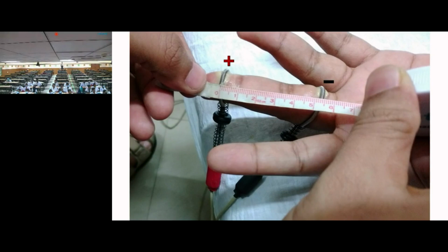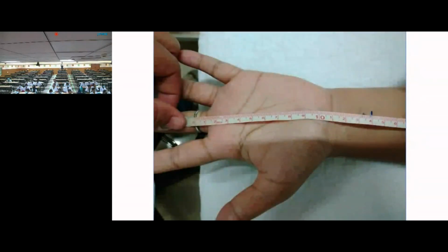Now we have to stimulate the nerve at a distant point, right? So usually for median nerve, we'll be keeping at 14 centimeter. That is where we are going to get the adequate response. So along the course of the nerve, from the active electrode, measuring 14 centimeter and using the sketch pen, we'll mark the stimulating area. Fine. So this is going to be 14 centimeter.